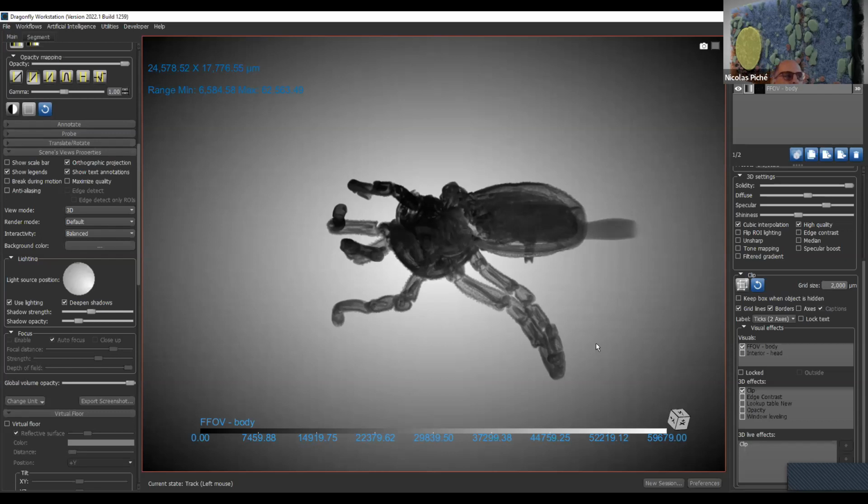Most of the time, you guys in CT and all that, what happens is that you have maybe a thicker Z than the XY, and you have an isotropic XY plane. But just to say that some of the complexity of our software and the coding of the code in the back comes from that. You know, NumPy and all that, you cannot do slicing in any direction using non-isotropic voxels. So we have tons of code to manage that. It's necessary because, again, we come from medical and we're used to dealing with strange acquisition spaces where the voxel can be mostly anything. With an MR, you can do very, very strange things.